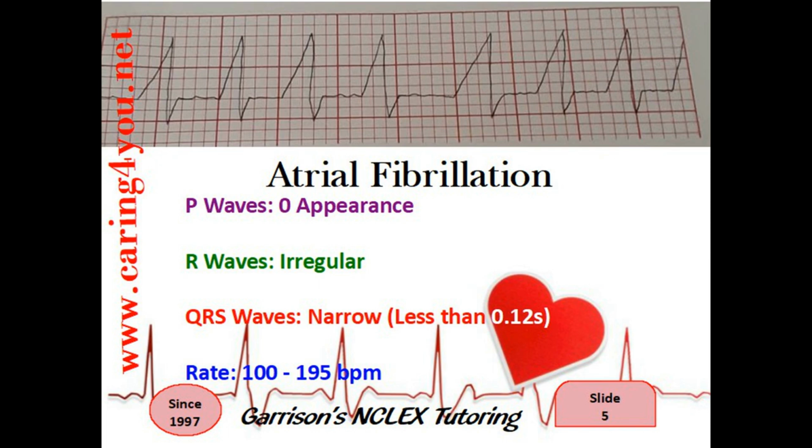Atrial flutter, atrial fibrillation, ventricular fibrillation, ventricular flutter, ventricular tachycardia, or MI. So what are those 5 strips that we're going to memorize?